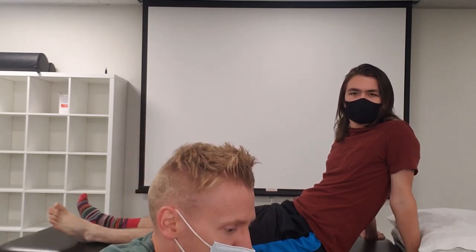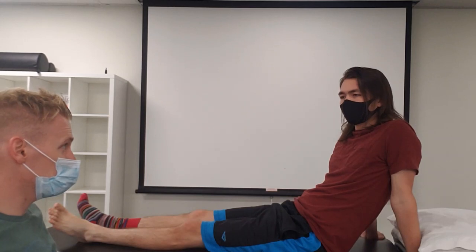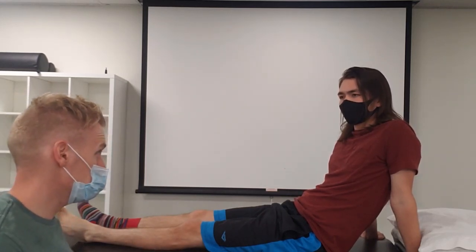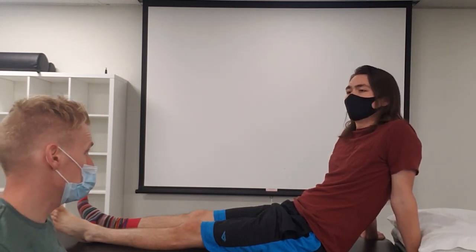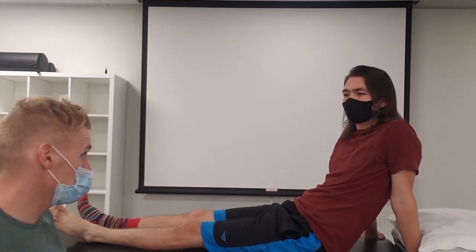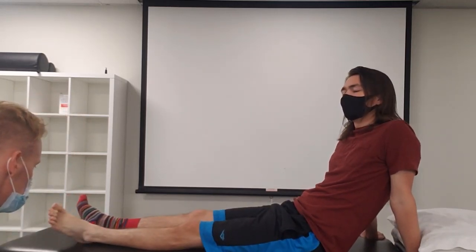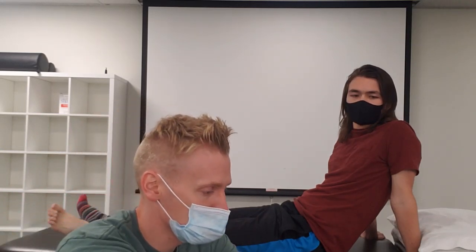So a couple of things before we start. There's a few things that we want to make sure aren't issues with this kind of treatment. So do you have any poor sensation in that area? No. Okay, so no problems with temperature regulation or anything like that? No. And do you have good circulation there? Does it seem like it? I think so. Okay, perfect. All right, so it sounds like that'll be fine then. We'll go ahead and move forward with the treatment.